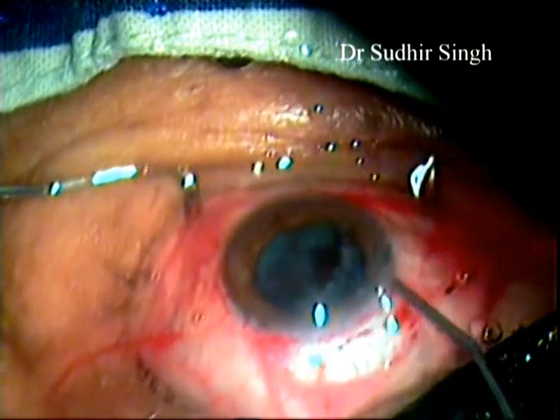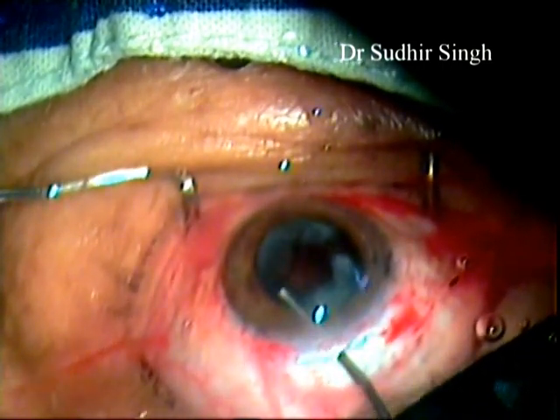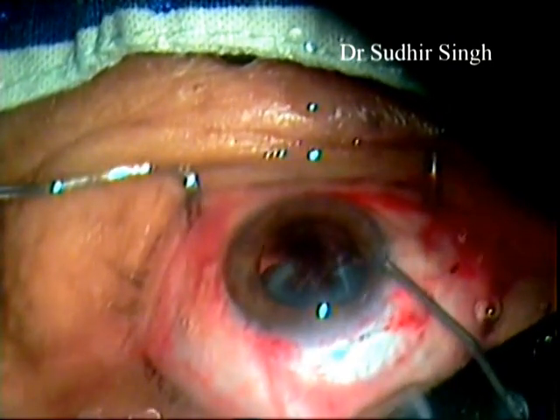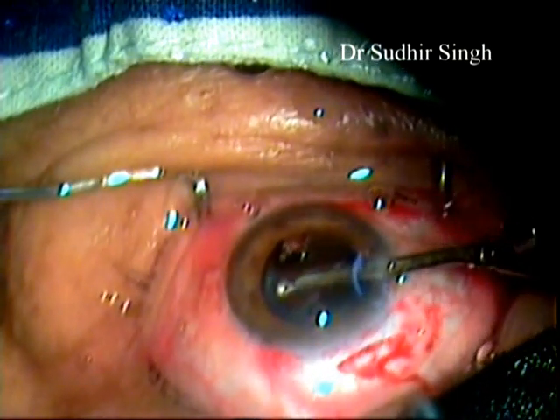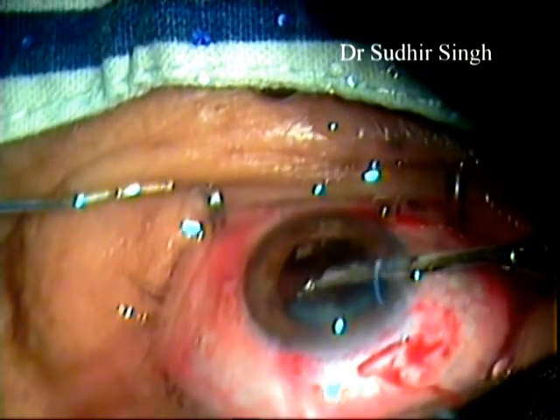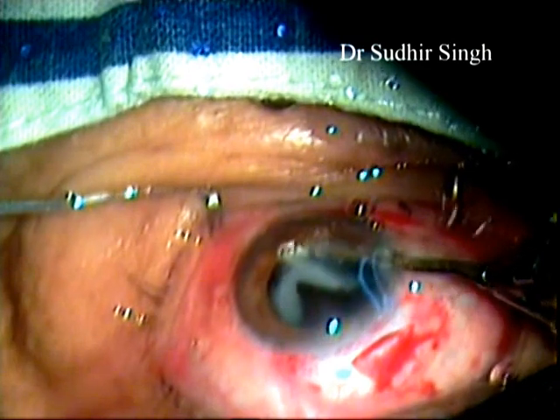Cortical matter and viscoelastics are flushed out with irrigating fluid filled in a 10cc syringe mounted with a hydrocannula. The remaining cortical matter is cleaned up with a 23-gauge Simcoe irrigation cannula from the side port.